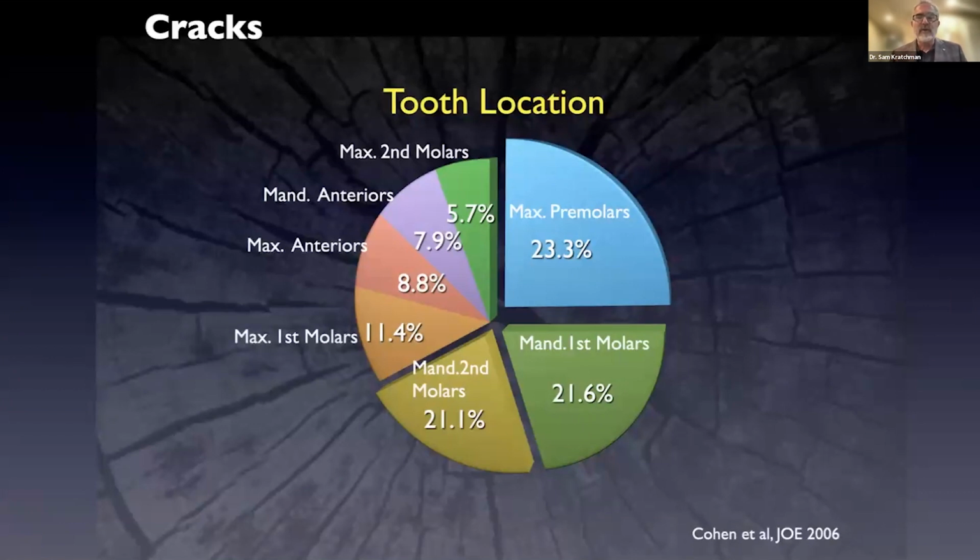So very important to know the predominance of where fractures happen.